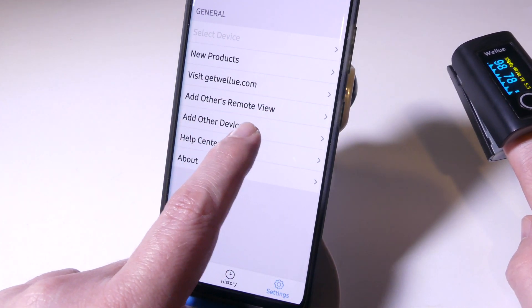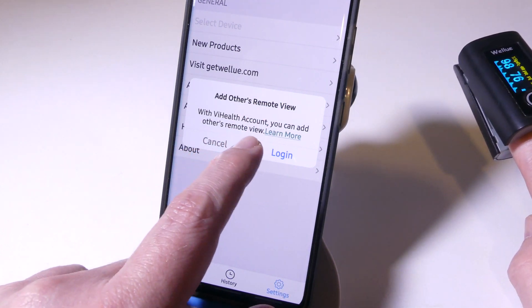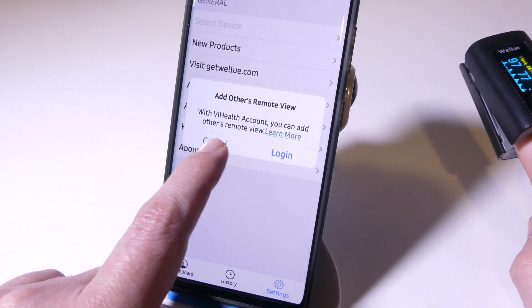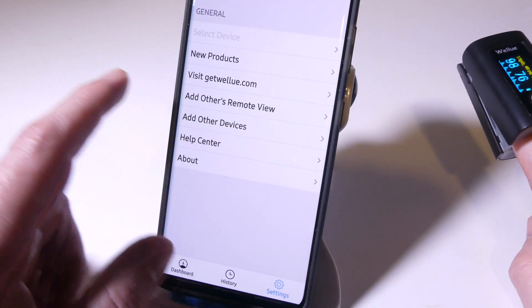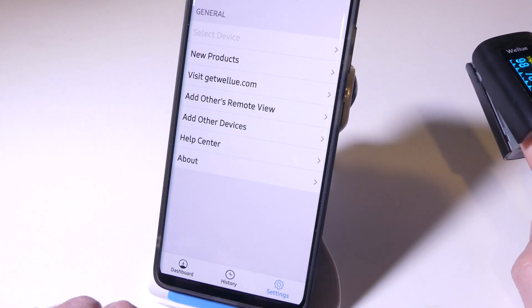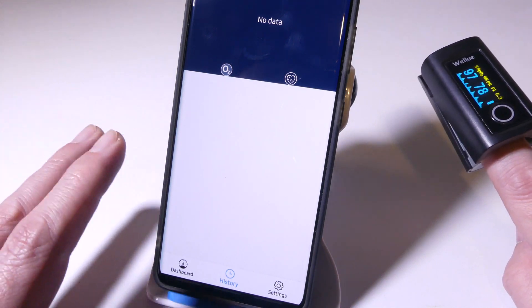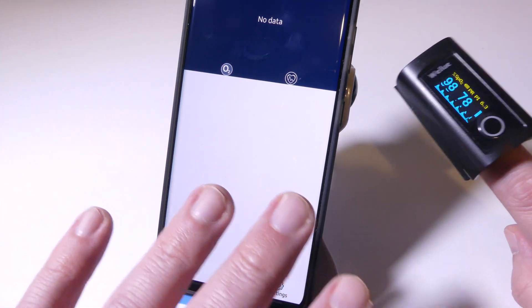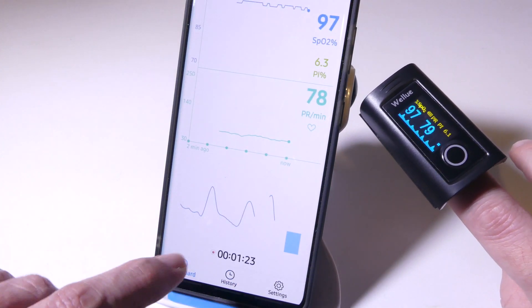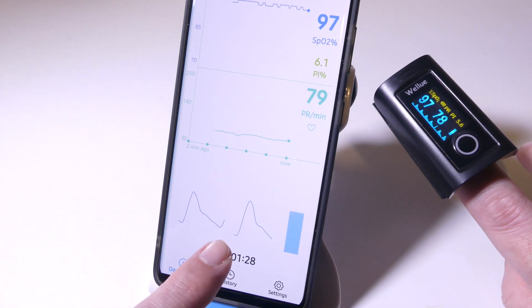You also have an 'add others' remote view option in the app. With a vHealth account, you can add other people, so even if you don't live in the same house, you can set it up so that when they're wearing this, you can remotely view their data from afar. In history, after you're done and exit the app, it'll save everything to history and you can go back in and check it out. It's a well-rounded, super useful app.